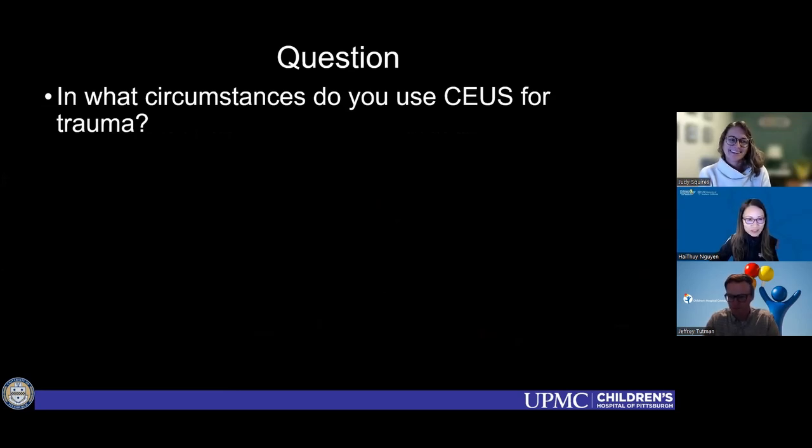My answer is easy. We just do not do it. And usually it's a staffing issue, probably, because only very few of us do contrast enhanced ultrasound. And so it's just not going to be available for traumatic cases.